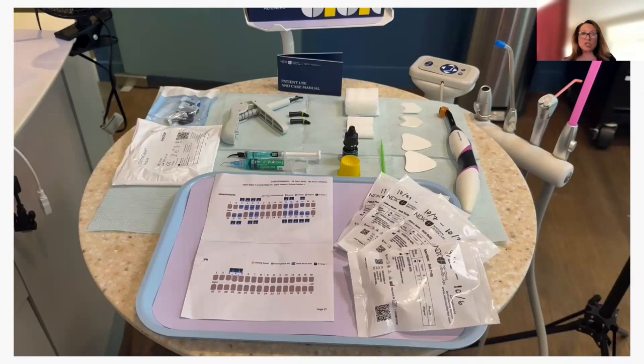You do not want to etch the whole tooth. You just want to etch where the attachments are going, because if you etch the whole tooth, you're going to get bonding, you're going to get the composite all over, and you're going to end up having to remove all that. And if you don't remove all of that, you have just caused another layer of your tooth.